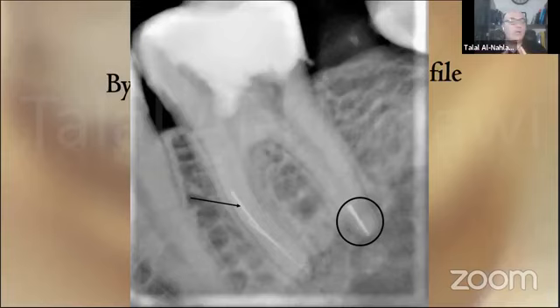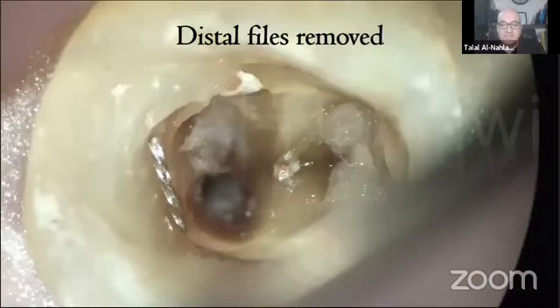It is not just when you get a catch, when you are lucky to get a catch. And by the way, not all the time will you be able to get a catch. If you are lucky, or if you take the precaution that was suggested by my friend to enlarge, to activate, whatever, you have to pay attention. You have to pay attention very well for the bypass, because when you instrument beside the broken file, sometimes it will be dangerous and you risk additional fracture of the file. So we now have 4 broken files in this case.